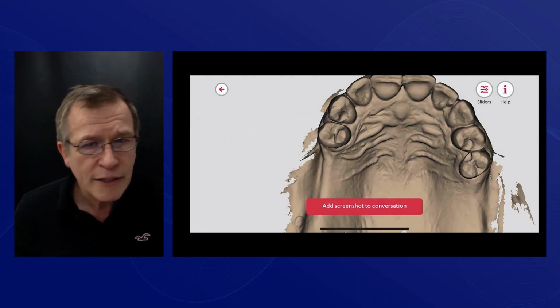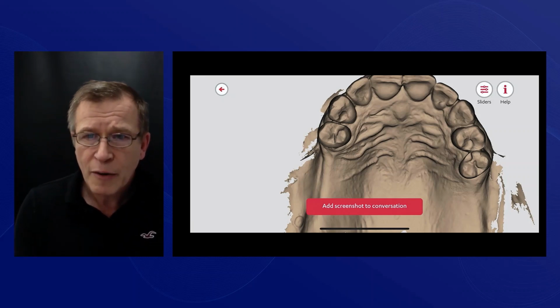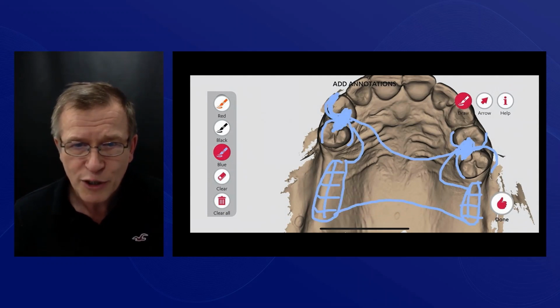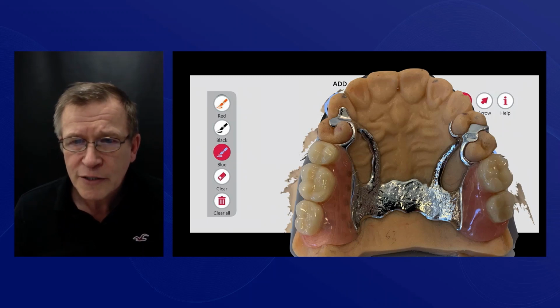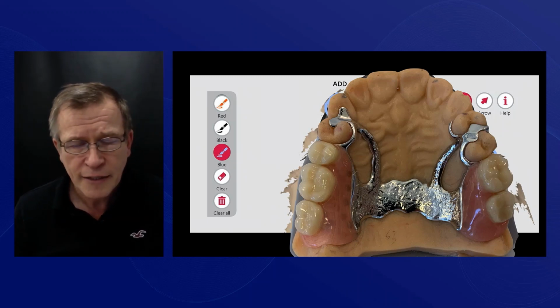So I say I don't do a great deal with dentures. Again, these are shared by my colleague, Martin Hayden. But here we are with a scan that we're able to mark up on the iPad what sort of design that we'd like. The lab can use the technology to do the design and print these things, and just amazing results that we're getting.